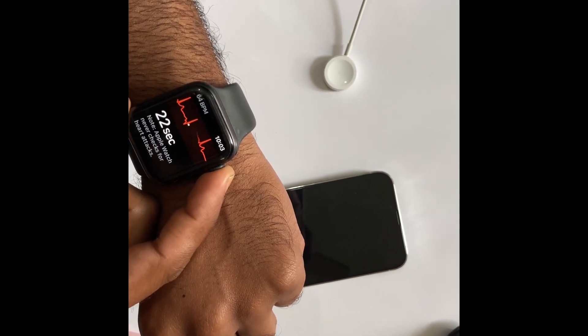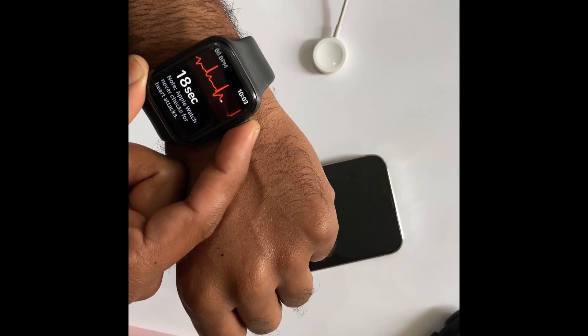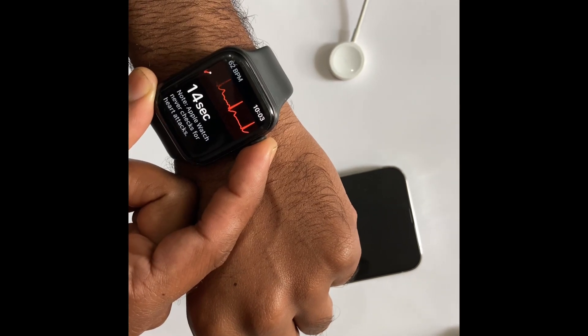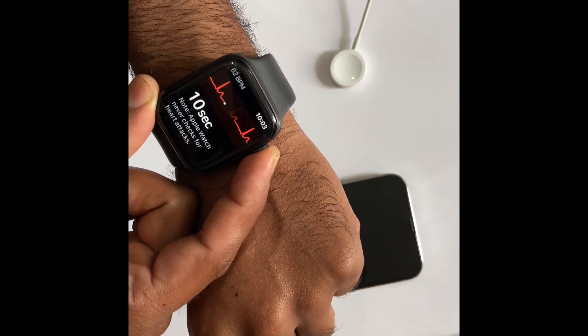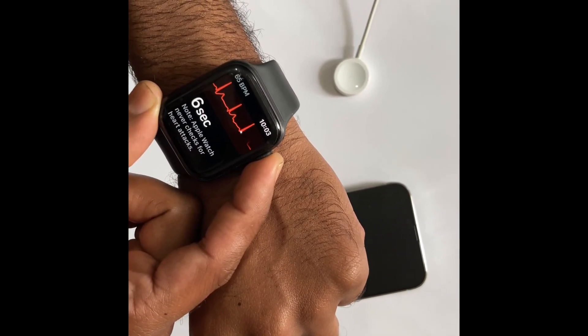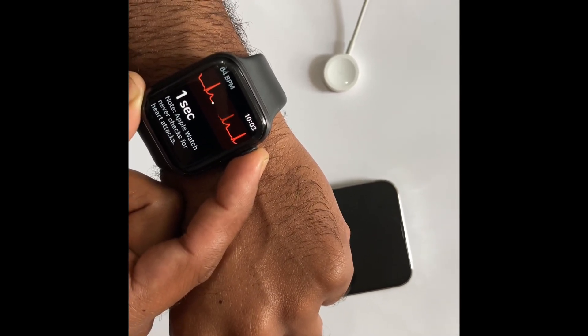Okay, now let's check it out. We can see the watch is taking the data from my finger. You have to hold your finger on the digital crown button very gently — don't press too hard, just very softly.